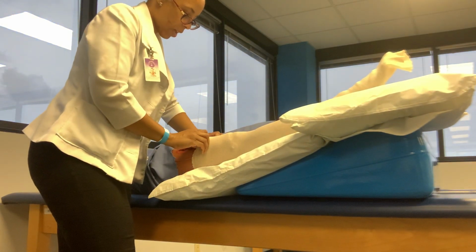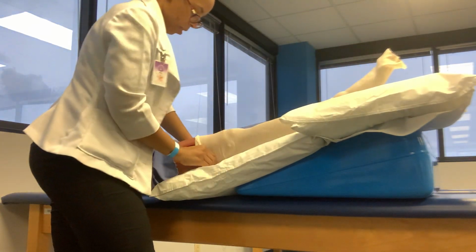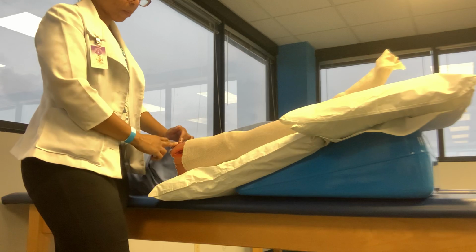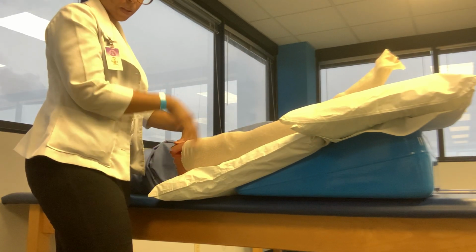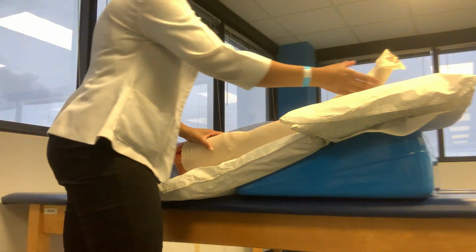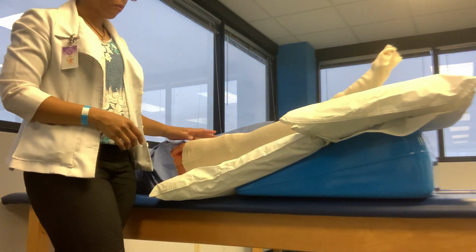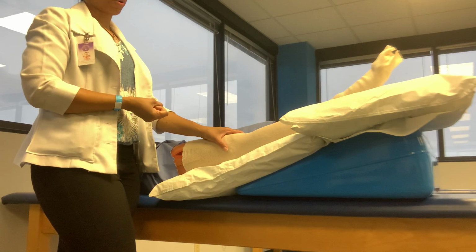So this one's going to be very exact for this patient's limb. So you want it to reach to just about the proximal thigh, because you want it to the length of the sleeve so that there's no touching of their skin against the machine. And the reason you want it long at the end is so that you can just give it a quick tug and you smooth out any wrinkles, because remember, one of the precautions is that wrinkles in the stockinette can cause bruising when we have high pressure.